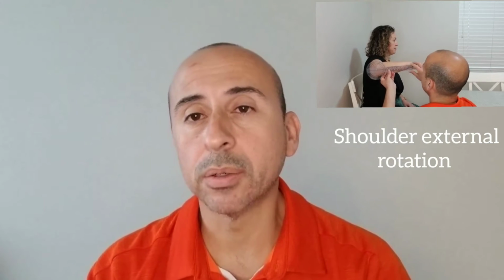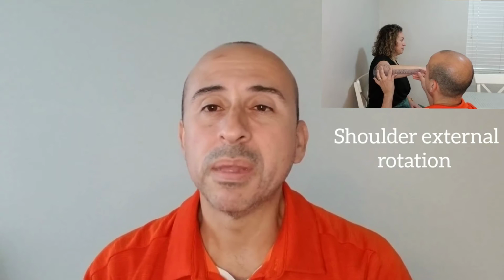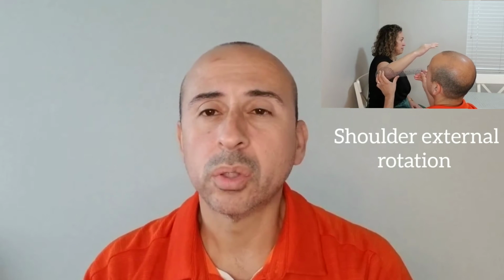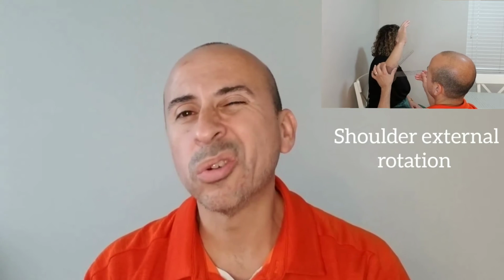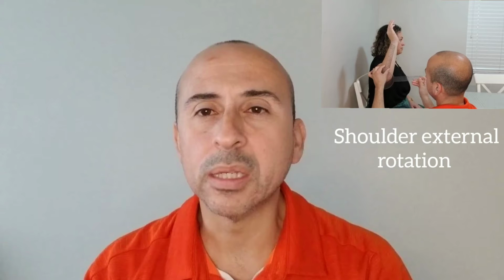Obviously, for goniometry, you want to make sure that you're looking out for any contraindications or precautions that you need to take. Things like sternal precautions, pacemakers, maybe rotator cuff injuries and pinched nerves, or maybe they have osteoarthritis in the shoulder and they're very limited. So you would definitely want to be paying attention to the quality of that joint.